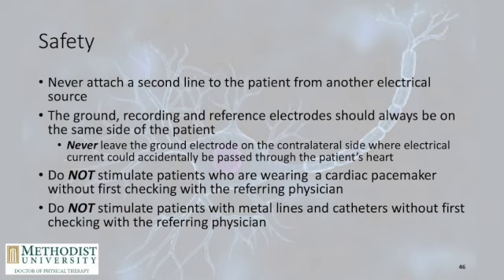A couple of safety notes here. These are the big safety notes with any sort of electric modality. Don't use it on someone with a pacemaker. You want to make sure that you check first and make sure it's okay. And then if they have metal lines and catheters and anything else that's going to zap them, you don't want to put electricity into something metal, obviously.